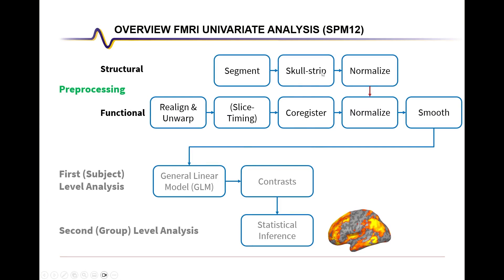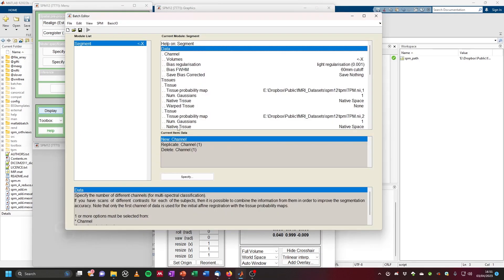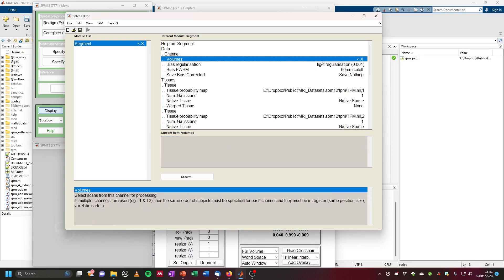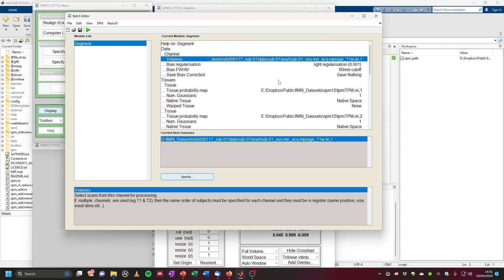Now we want to pre-process this structural image. As mentioned, structural pre-processing involves segmentation, skull stripping, and normalization. Let's start with segmentation. In SPM, click on segment and the batch editor will open. The first thing we want to do is select our structural image as the volume — click on volumes, then specify, paste the folder path, select the T1-weighted image, and click done. Now it's selected as the volume we want to segment.